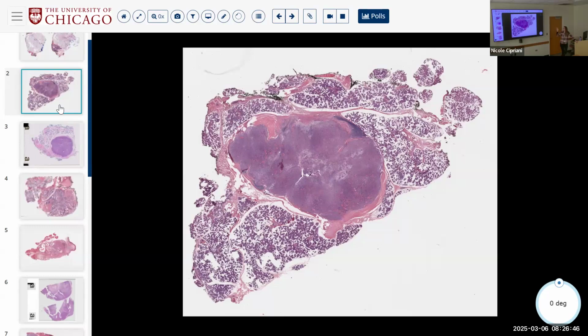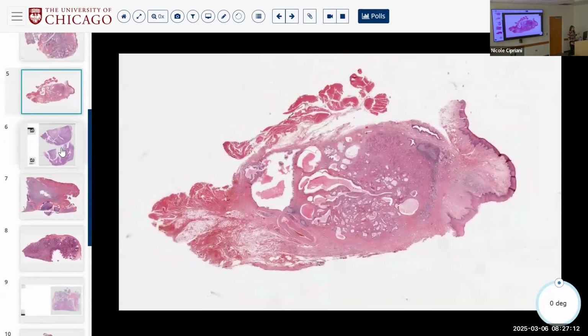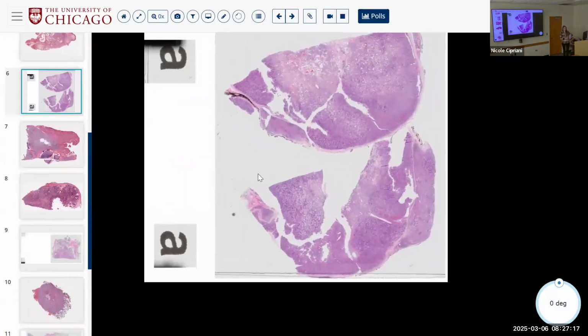So basically, you can have a biphasic, PLAG rearranged, chondroid or myxoid rich tumor in any of these anatomic sites in which the name essentially varies. Chondroid syringoma. Thank you. So chondroid syringoma in skin, benign mixed tumor of soft tissue, pleomorphic adenoma of salivary. Same thing. All right, BCA, Warthin, mucoep. Okay. Next.